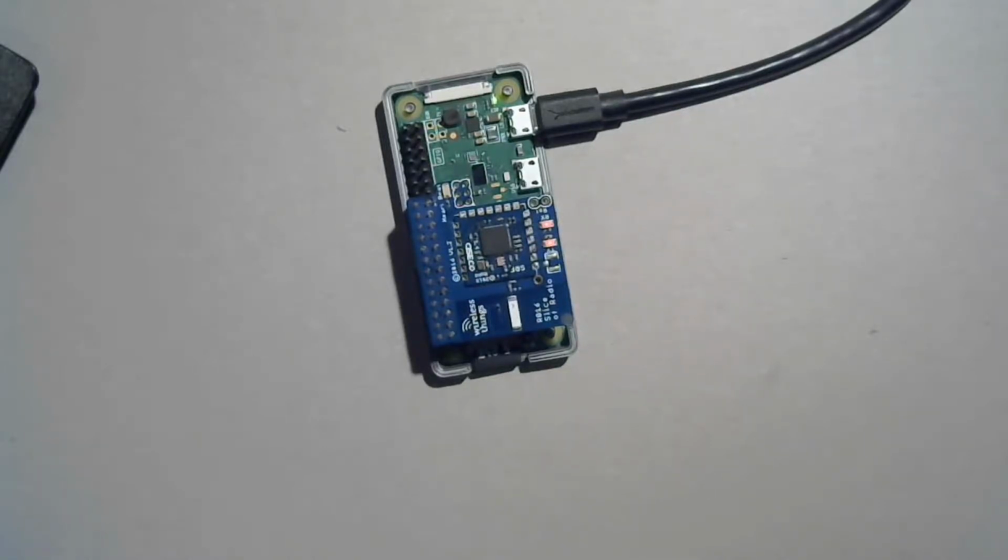Further down, there's a history page, which is more generic information about the pump. It's like really just generally speaking what's going on in the pump. If I calibrate my CGM, or if I set the date and time, change the battery, any one of those things that would happen gets written into the history so that you can debug and troubleshoot. So that's the history page. And ultimately, it really just supports those 4 things. And up until now, that's been good. But tonight, I want to add a different one.